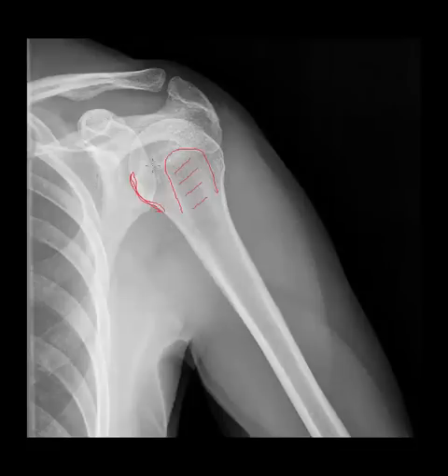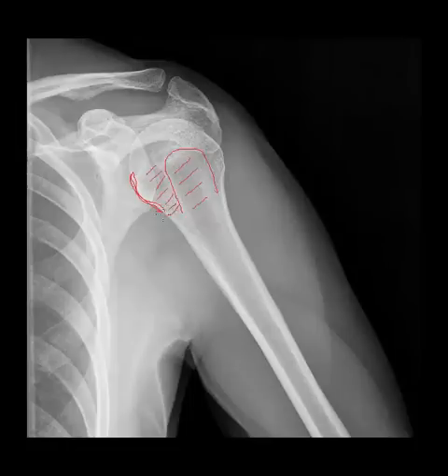The intertubercular groove will be in this location on the internal rotation view as well. This is where the long head of the biceps tendon passes before it inserts into the shoulder. The bicipital tendon can become dislocated, though radiographically you can't see that. The bicipital groove, also known as the intertubercular groove, is the region where that tendon lives normally.